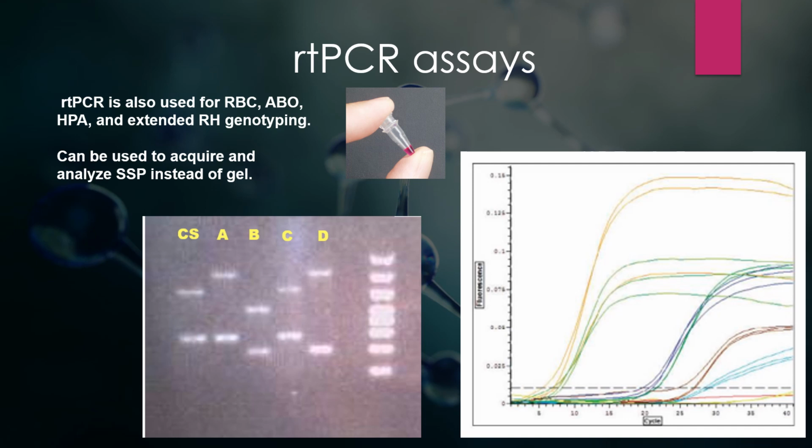The downside is you can only test one patient or donor at a time, and each well is only positive for 1 or 2 SNPs, as opposed to the multiplex PCRs that we're doing for ID-Core and BioArray. So, for example, each well would be a different SNP.